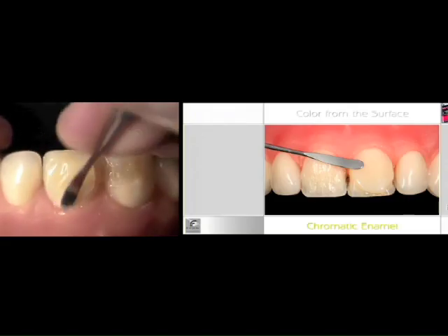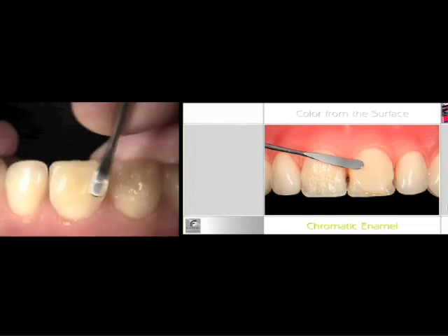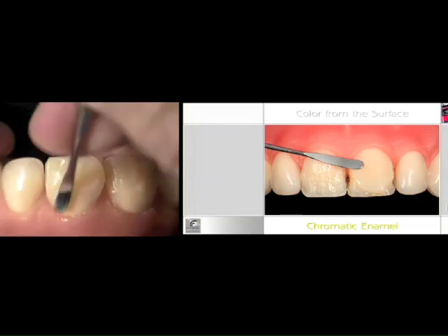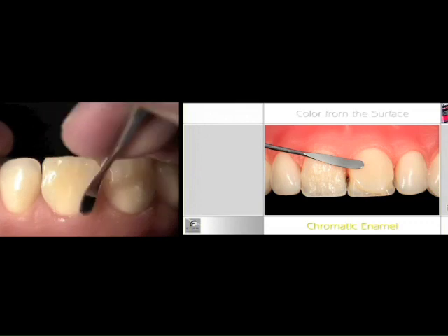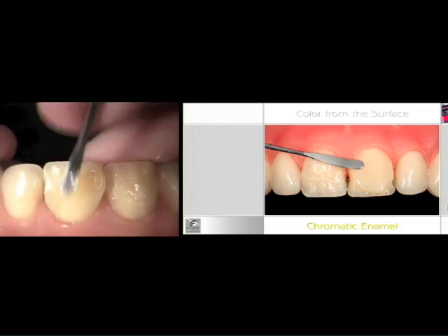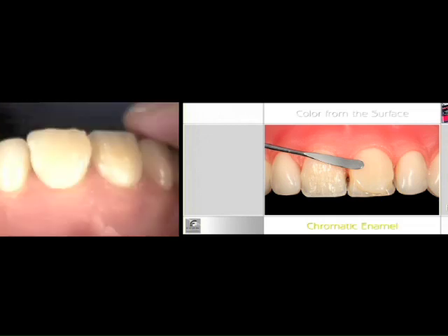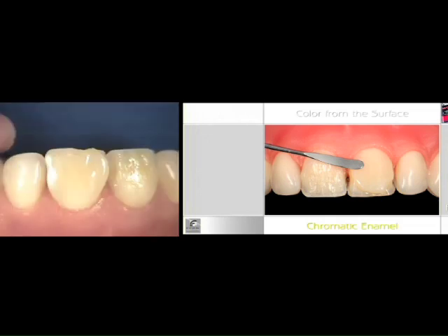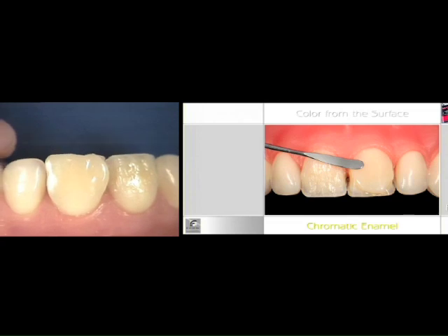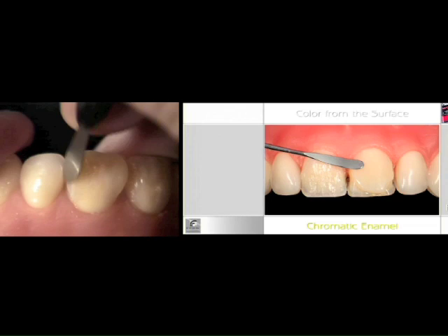Here's a little clinical hint — a tip. Whenever you're using a body enamel and value enamels, or incisal enamels at the incisal, you want to make sure that you create a contour that is the exact contour of what you would want in your restoration.